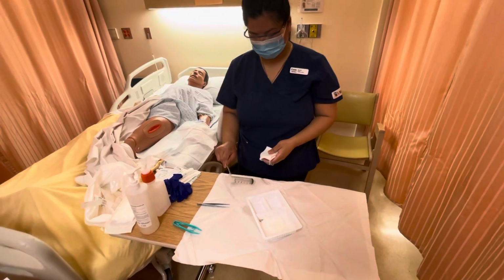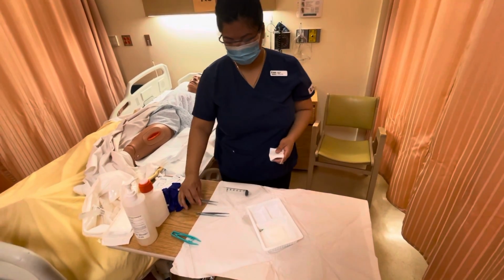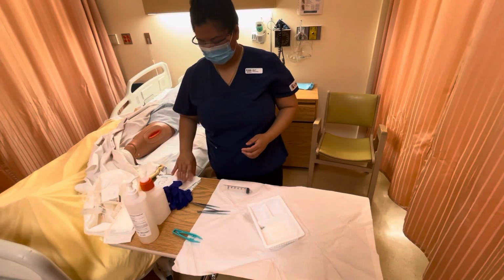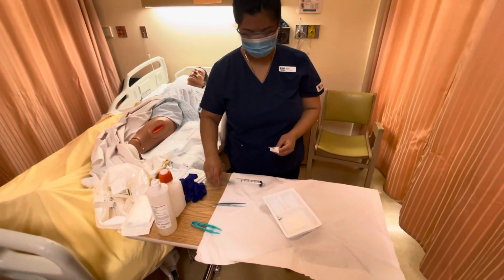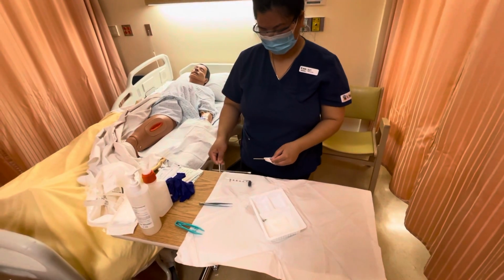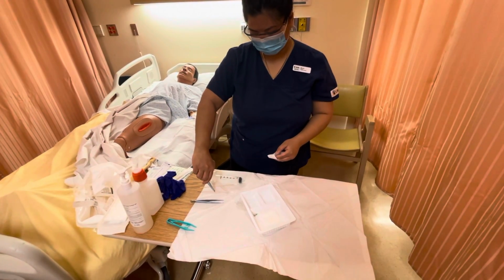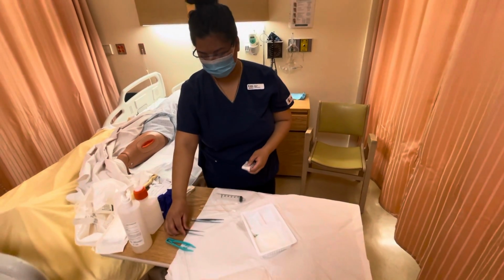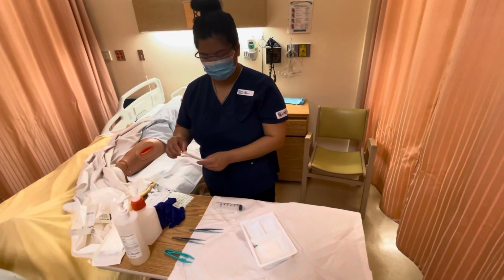And I'm also gonna need some cotton tape, swabs. And I'll open up another one.